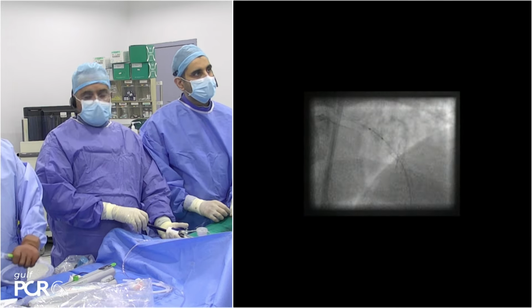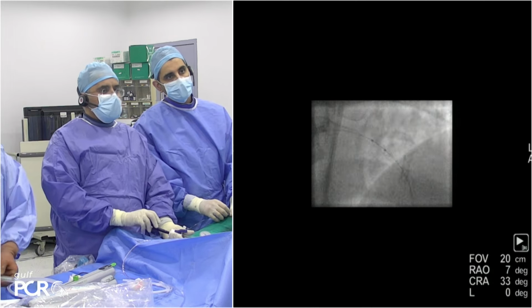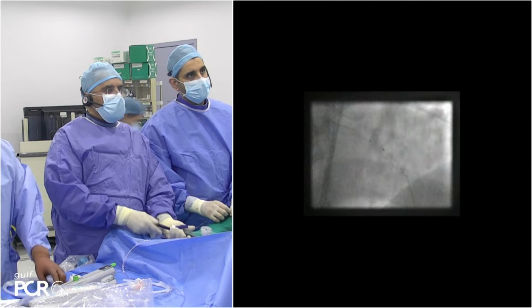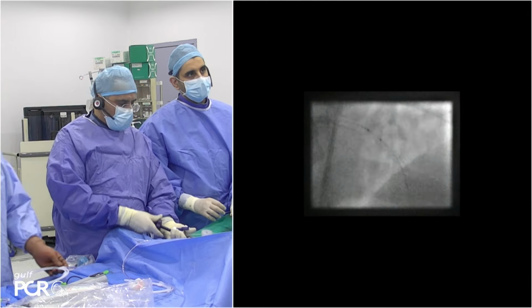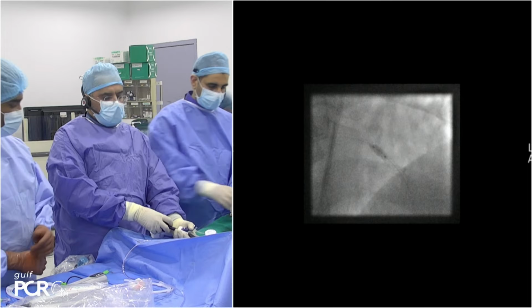Ibrahim, I think stent viz is an important assist in these cases. When you do stent boost, it shows you the contour of the stent, and it will usually show you the nodule if it's still pinching on the side of the stent. So I think stent enhancement techniques are useful.